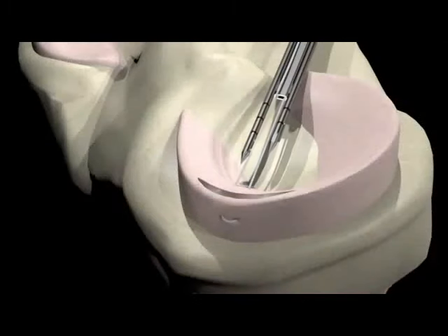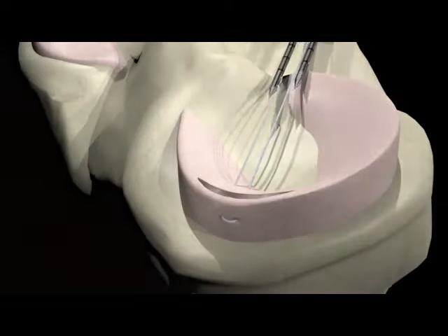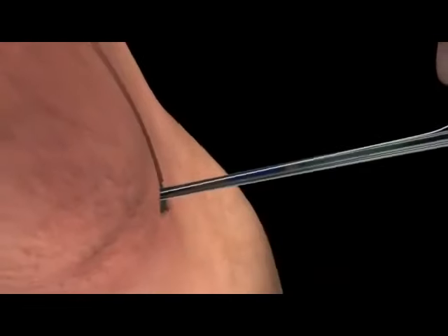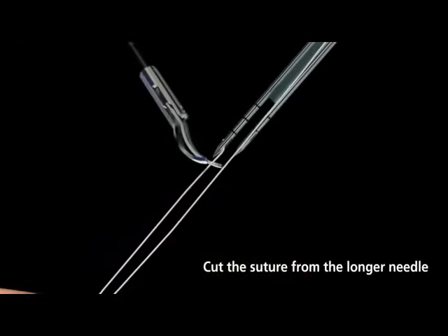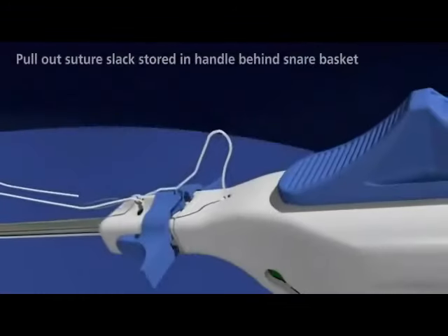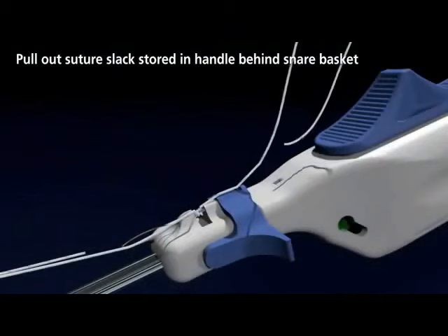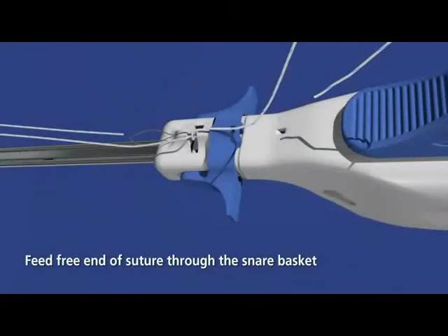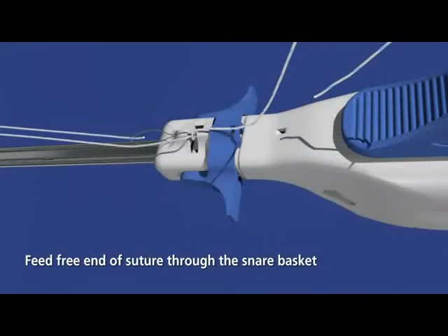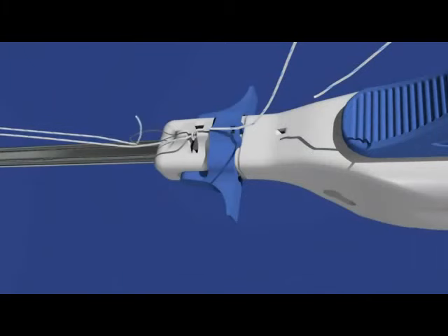The suture will deploy from the device, passing the suture across the tear. Cut the free end of the suture from the long needle. Pull out suture slack stored in the handle behind the snare basket. Feed the free end of the suture, about 2 to 3 inches, into the snare basket located on the distal end of the handle.